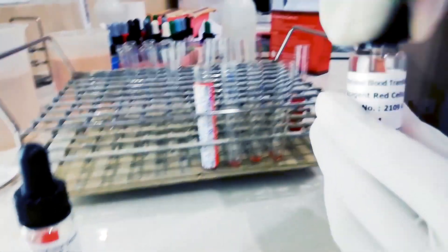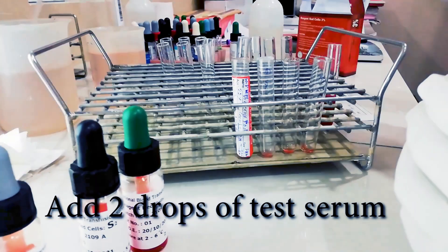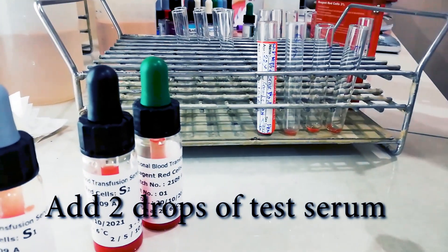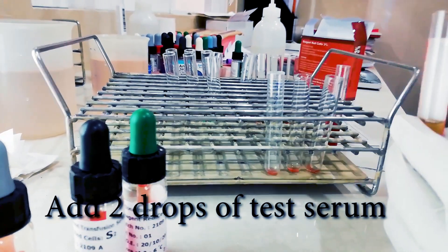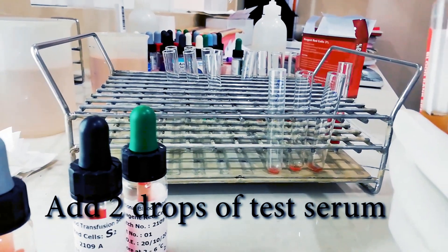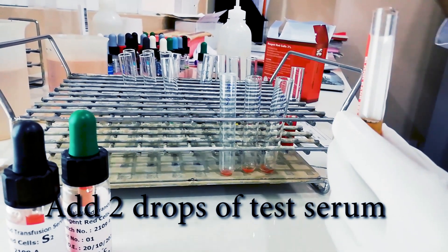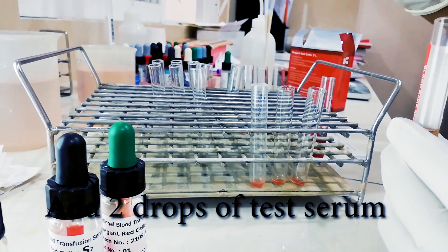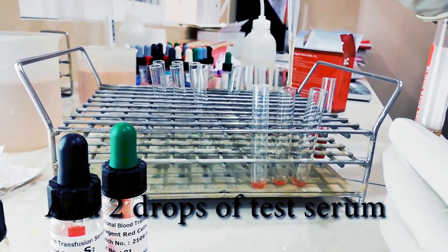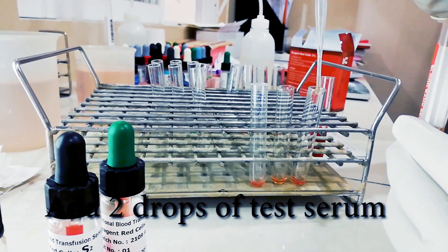After that, we have to add two drops of serum into each tube. For each tube we add two drops of serum: one, two; one, two.